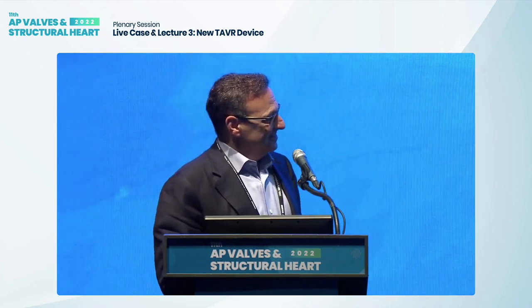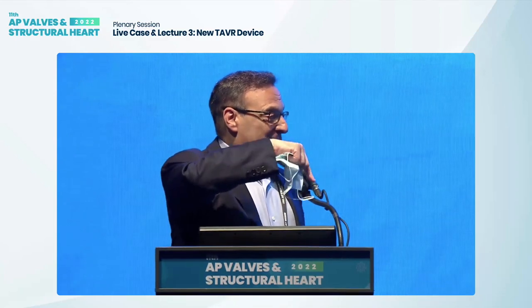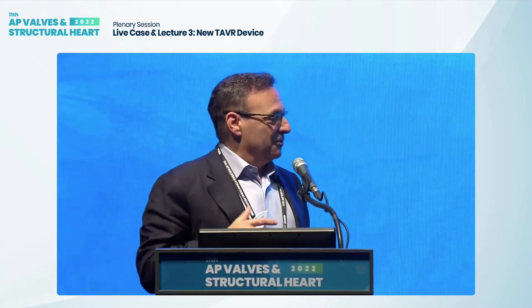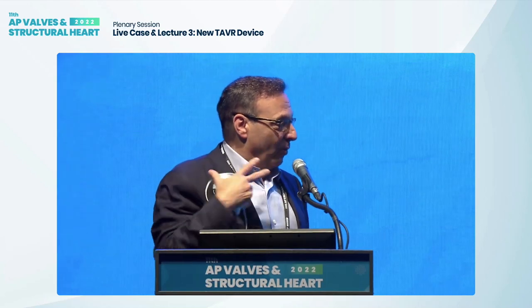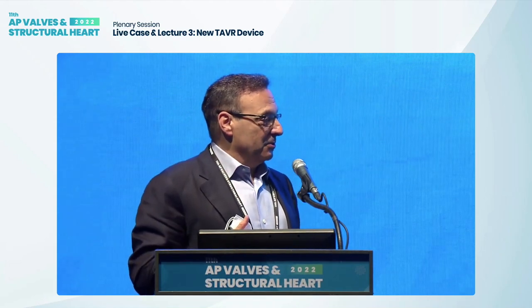Why didn't you use it in the ones that you identified, bicuspid and valve-in-valve? Why don't we use it in Kansas City? Yeah. We use it in those for sure. But again, New York City, for a variety of reasons, is a very competitive environment where everybody feels compelled to use every single thing. So we use it unless the arch anatomy is unfavorable or we can't position it; we use it in everybody now. But again, I would say that the evidence is not that strong that that's the right thing to do.